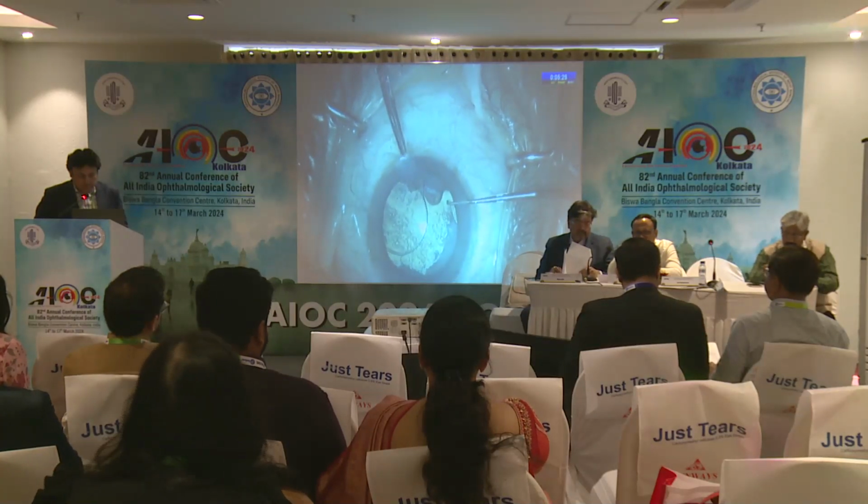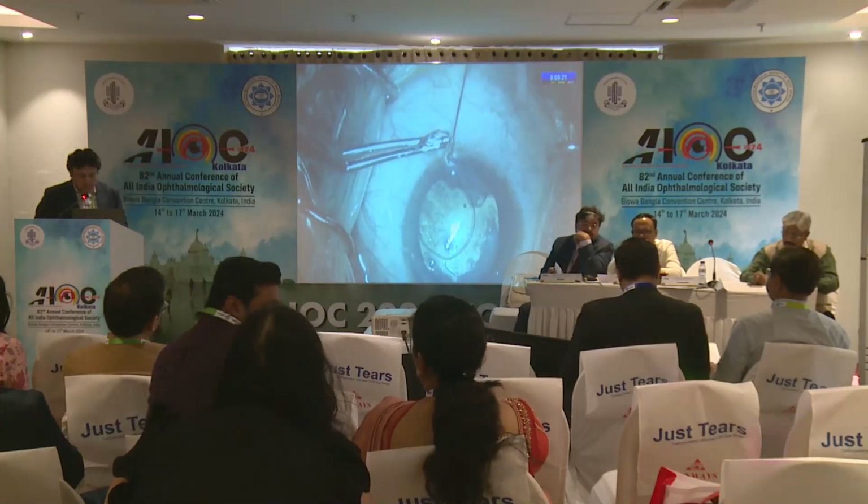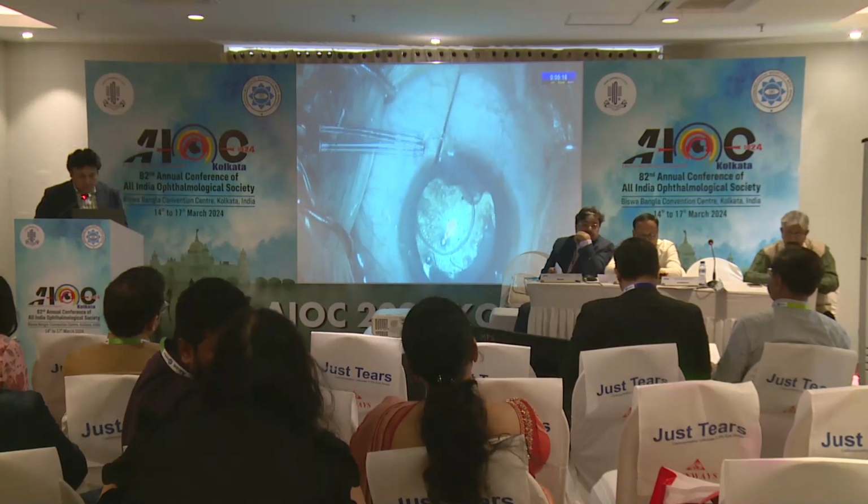anterior chamber. 6-0 Prolene is threaded in the outer haptic and a flange is formed by cautery. The flange is strong and is confirmed by a pull.